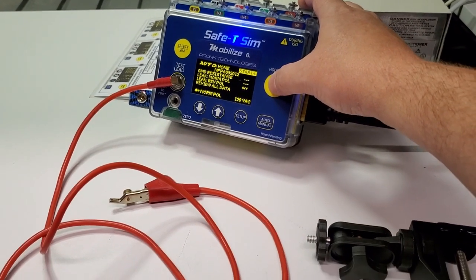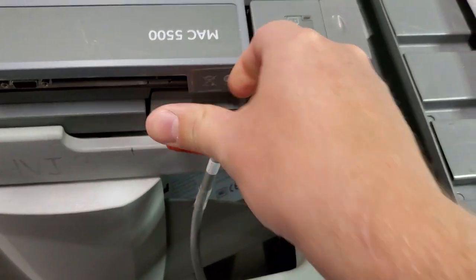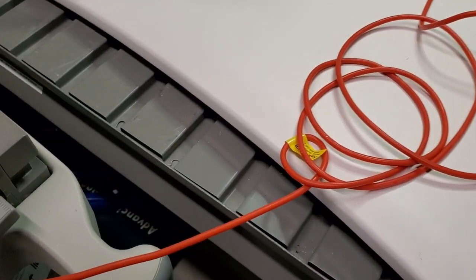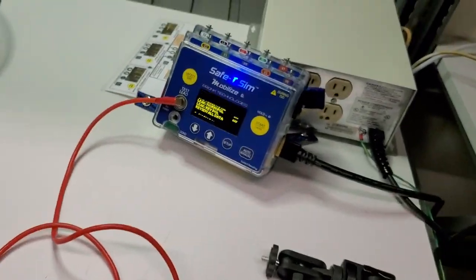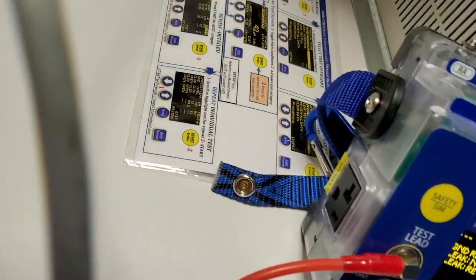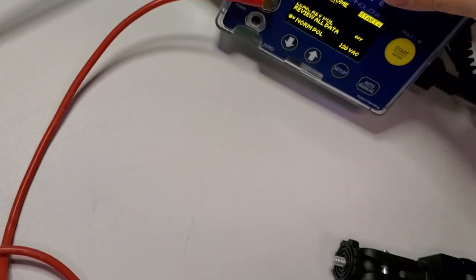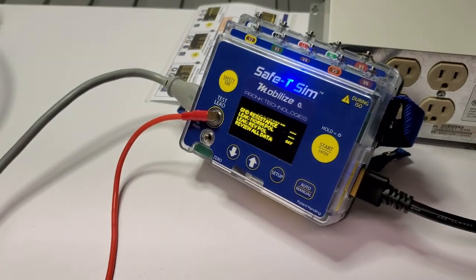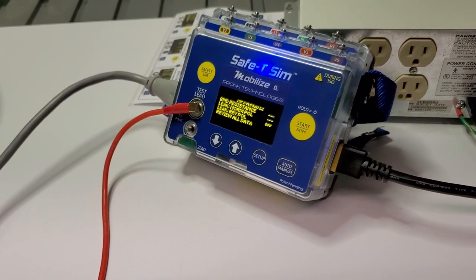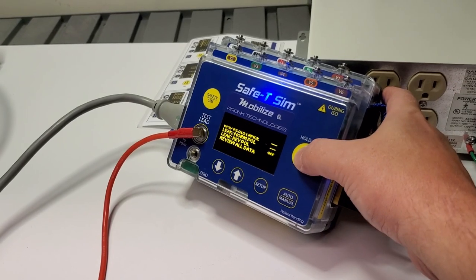It says would you like to start — let's go ahead and connect it up to our device. The port for plugging stuff in is over here. All right, it is ready to do an automated test, so go ahead and click on start.